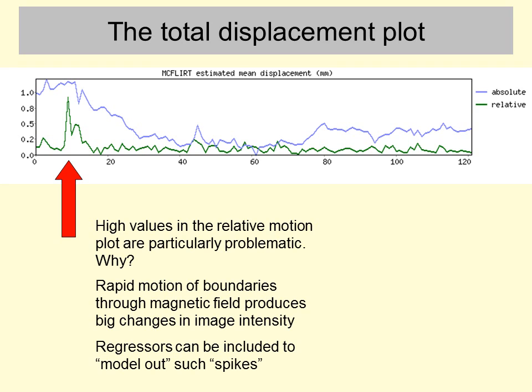And the change in the distortions of the magnetic field changes the actual image intensities that are recorded for particular tissue types. So then you've got a double problem. You haven't just got an incorrect mapping between voxel XYZ coordinate and anatomy, you've also got a change in the value of image intensity that was recorded, which is irrecoverable.